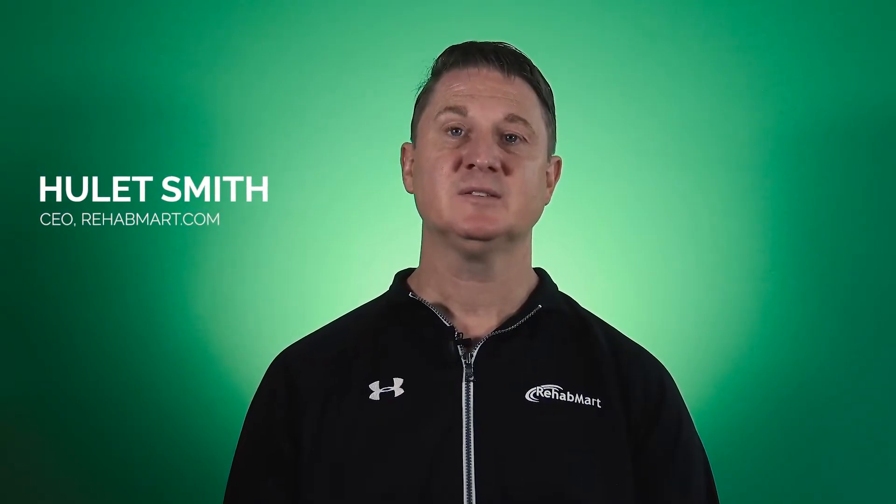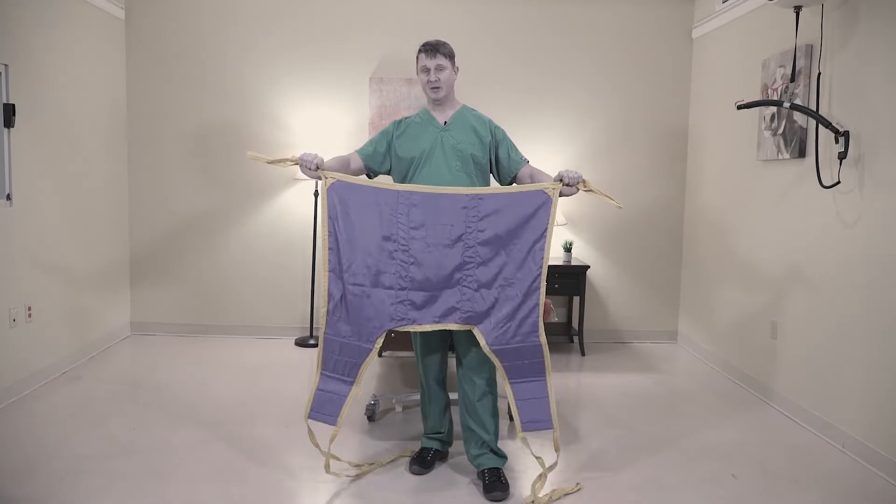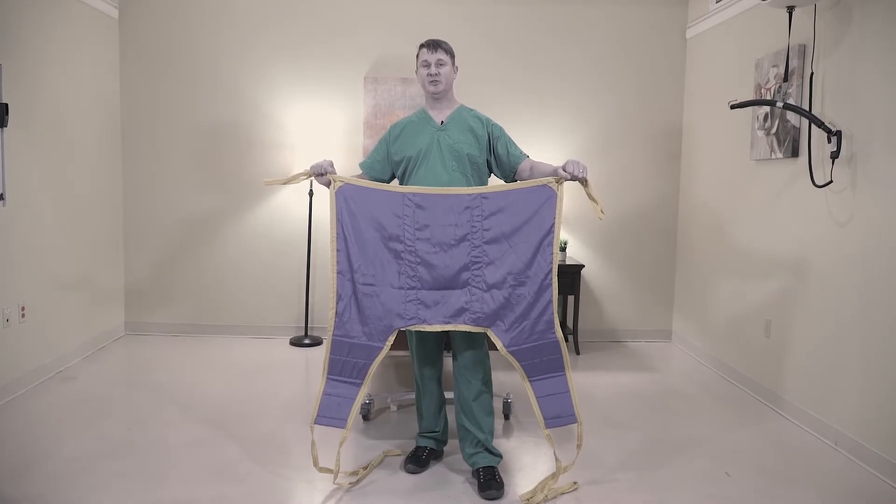The first step to any transfer is ensuring that you have the correct sling, so be sure to check out our detailed sling selection guide before diving into these how-to videos. Today we're going to demonstrate how to safely transfer a patient from their wheelchair to a toilet using a toileting sling.